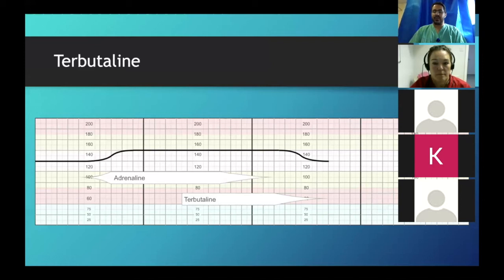Now, a very important point, the other thing is that variability should not just go off. If the variability has gone off, that means the adrenaline is now working, the terbutaline is stimulating the baby to cause even more tachycardia, which is putting more overload, and that's basically causing brain vasoconstriction. Does that make sense? Yes, it does make sense. Sorry, I'm just processing.